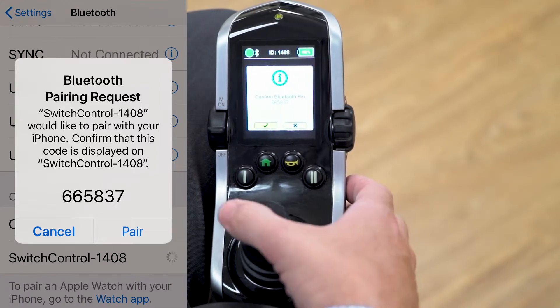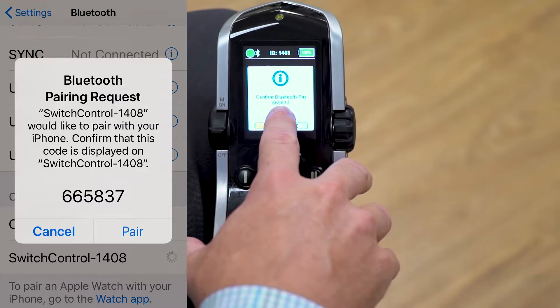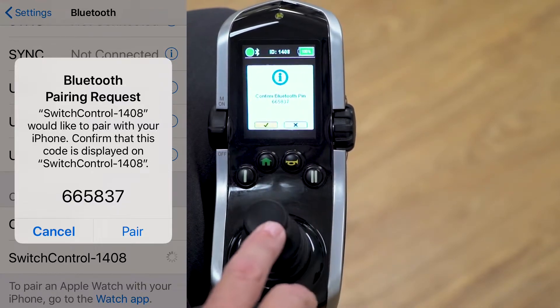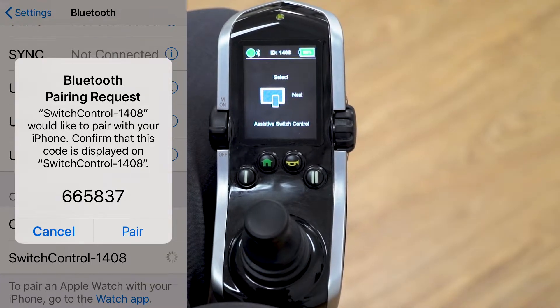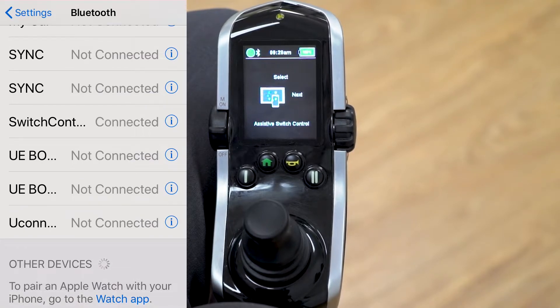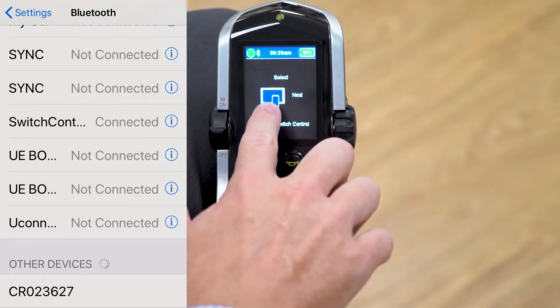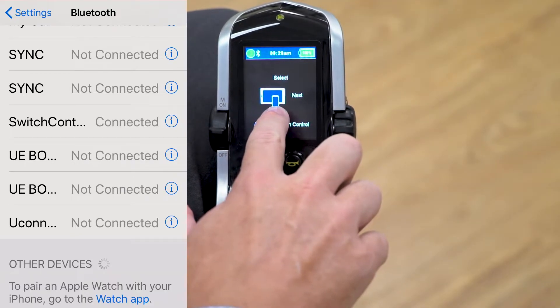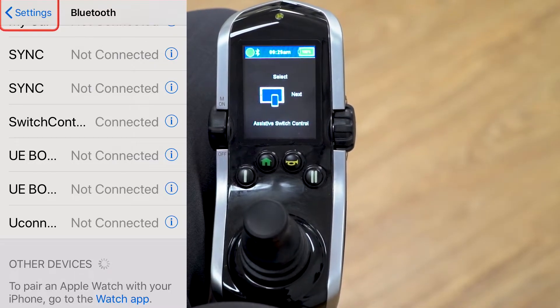On the wheelchair electronics, it's going to ask you to confirm the Bluetooth PIN. Look at your iPhone and make sure they're the same. If it is the same, give a forward command on the input device to select it, then click Pair on your iPhone. The switch control is now connected — you can see the screen is blue, which shows there is a Bluetooth connection.